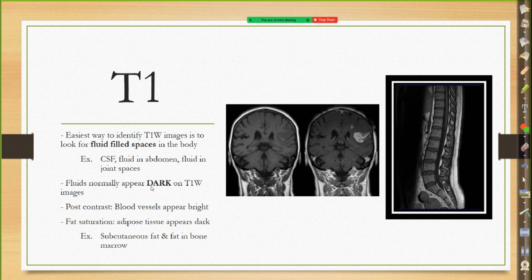Okay? But just go off once again, the ventricles are dark. And another way to double check is, oh yeah, fat. Fat's bright on a T1. So our subcutaneous fat is also bright. Going over here, in that second image, the bright that's showing is actually the contrast.